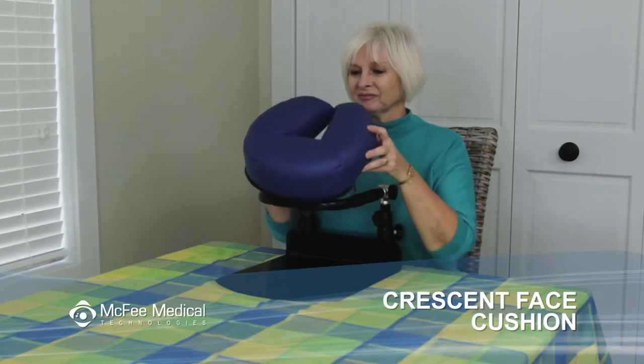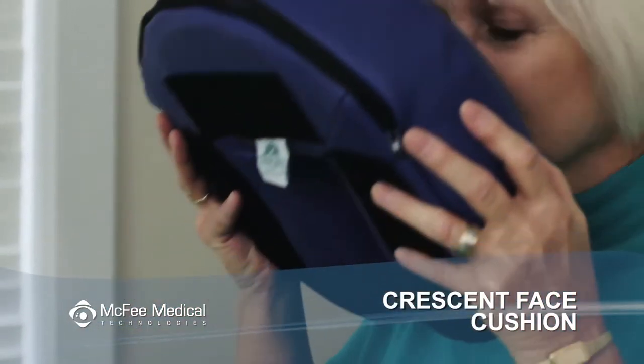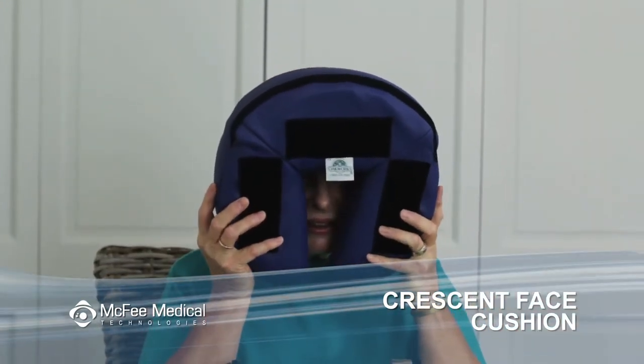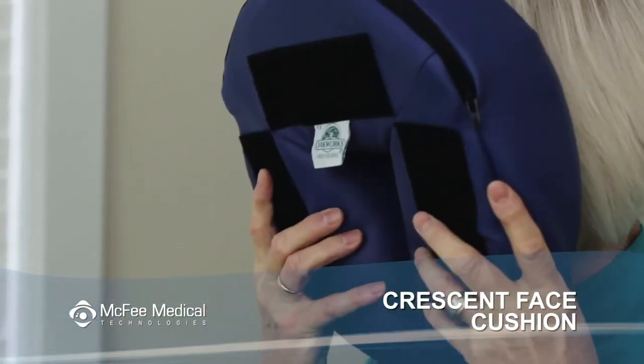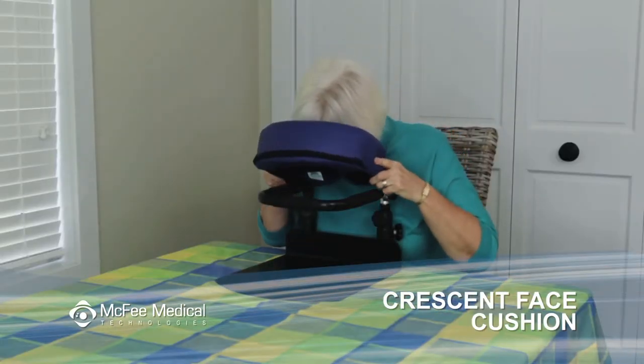The crescent pad is attached to the face rest platform with velcro. To remove it, just give it a good tug. Hold it up to your face so that the top of the crescent covers your forehead but not your eyes, and the two points of the bottom cradle your chin. The open end of the crescent can be moved close together for smaller faces or further apart for larger ones. Now lean over the platform and settle the crescent pad in place.